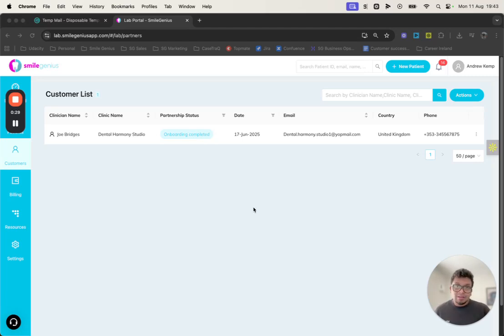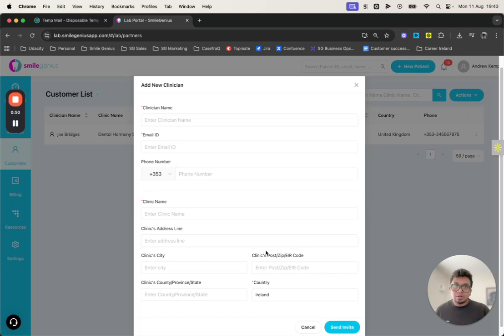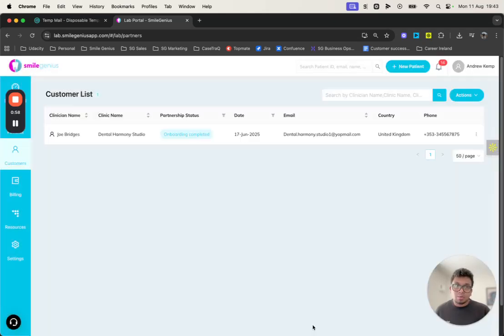That being said, we've gone a bit above and beyond to make this journey a lot smoother for people like these lab managers and administrators who get pretty frustrated. For a lab that's running small operations, or a lab that is already onboarded onto Smile Genius and wants to continue growing their business, a simple add manual form would allow the dental lab administrator as well as the manager to send the invite one by one to every clinician that they work with.